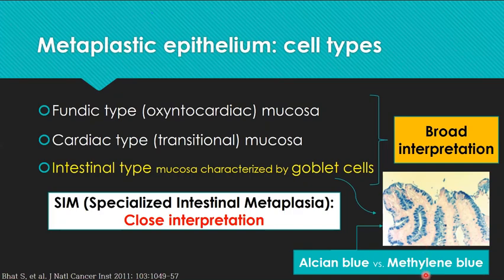And traditionally in the European countries, maybe our professor can give me some comment on this, methylene blue is quite an important technique. But before methylene blue, we usually use acetic acid. So after using acetic acid, methylene blue chromoendoscopy, after using a cap attached.